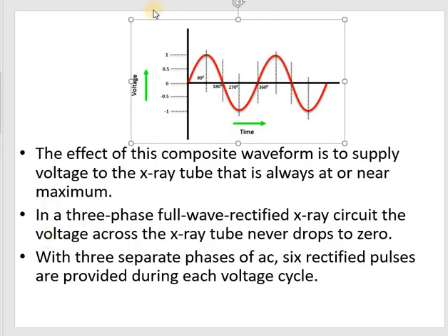The phase wire carries the current to the load, and the neutral wire provides the return path. Depending on where you live, the voltage is up to 230. In Malaysia, we run on 240 volts at 50 Hz frequency.